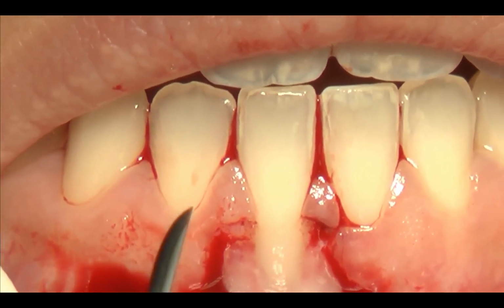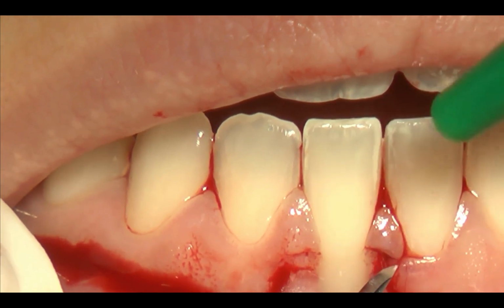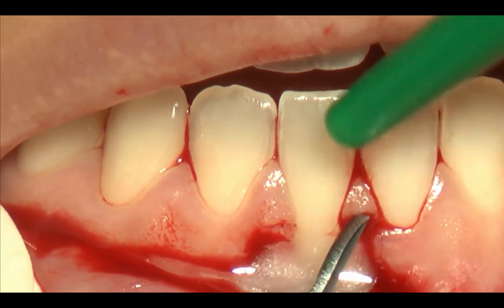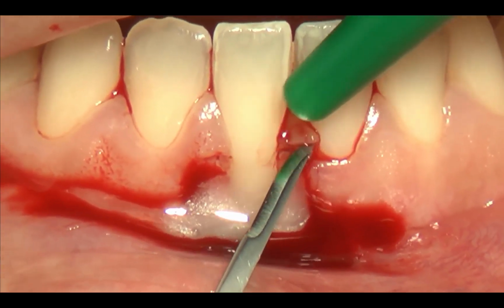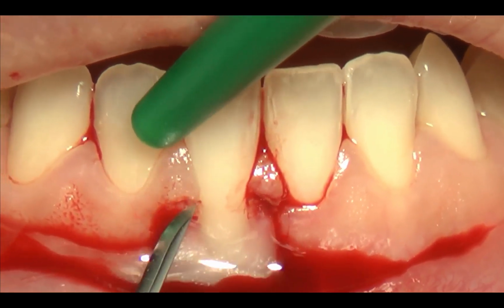As I told you, we have to go with the knife to prepare the base of this. When the base is prepared, you can follow the cut with the scissors, but never before.